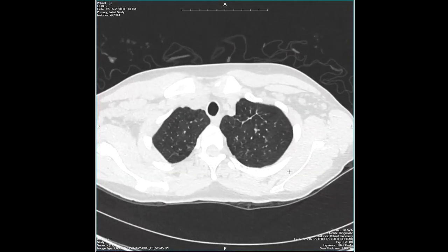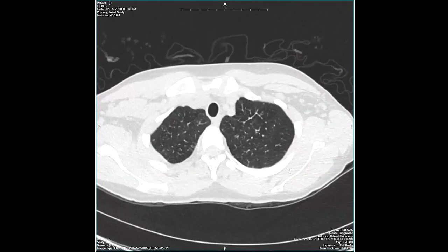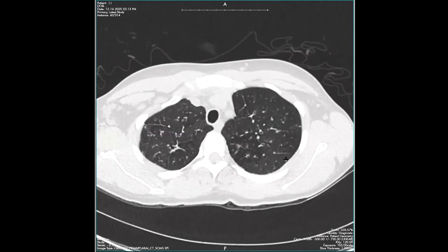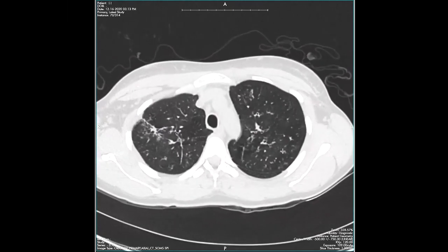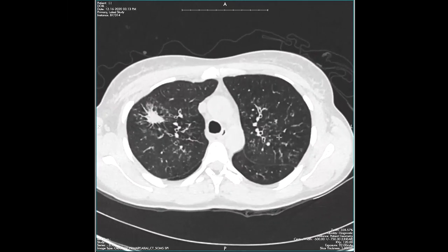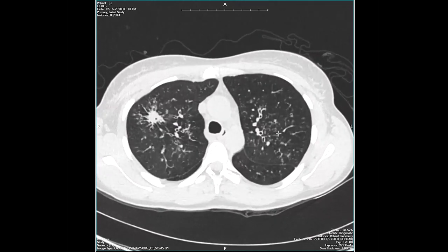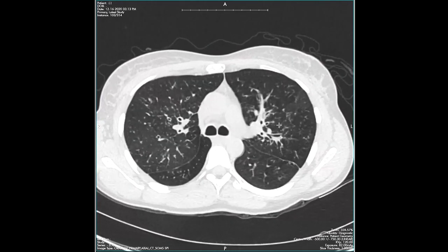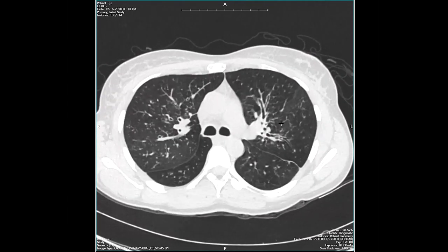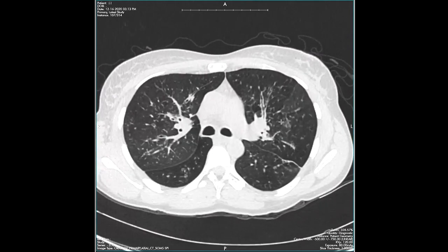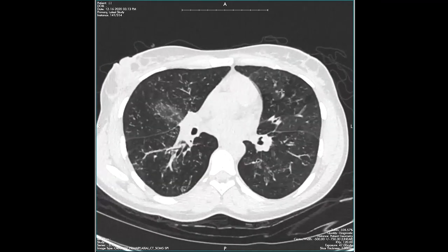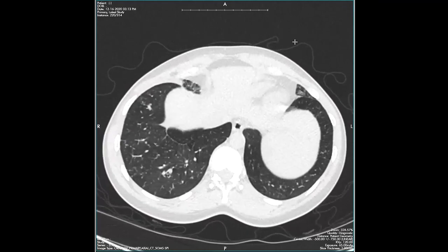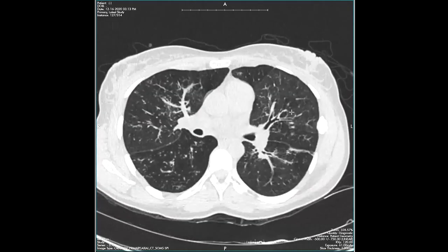Let's walk through some unknown cases now. This is somebody that had a history of anterior uveitis in the past. Looking through their CT, we can see that there are multiple tiny nodules and masses within the lung parenchyma. We can also see that there are some areas of architectural distortion with a little bit of traction bronchiectasis and bronchial wall thickening. The disease is fairly diffuse throughout the lung parenchyma.